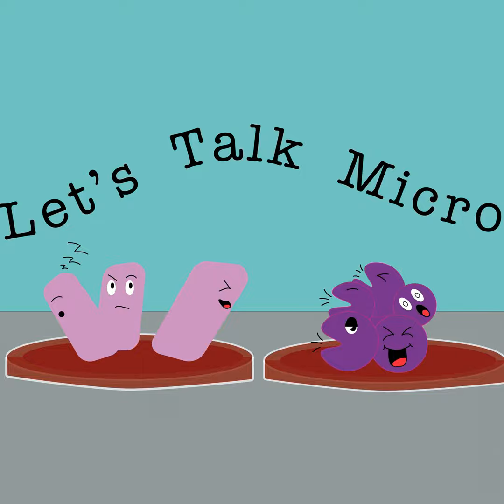So that's basically your strep typing, and then you keep that in hand with the PYR testing, right? Because if you have beta hemolytic strep and you have a PYR positive, then you go ahead and do the typing for A. If you have a PYR negative, then you do C, F, and G. And like I mentioned before, Streptococcus B has a very distinctive morphology. So for that one, you can still type it, but if you have a PYR negative beta strep, you can start with C, F, and G, and then maybe try B.